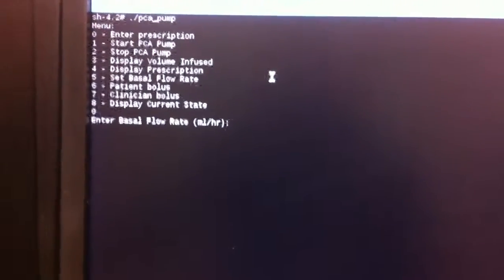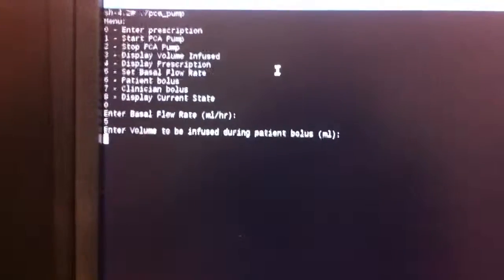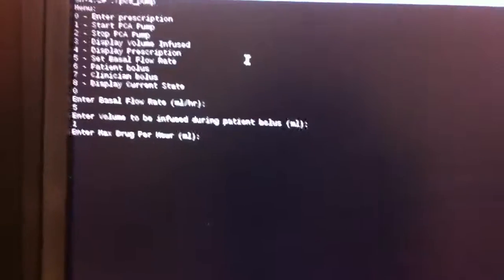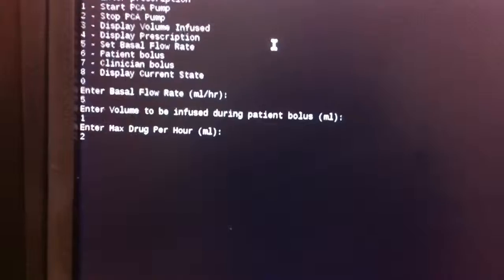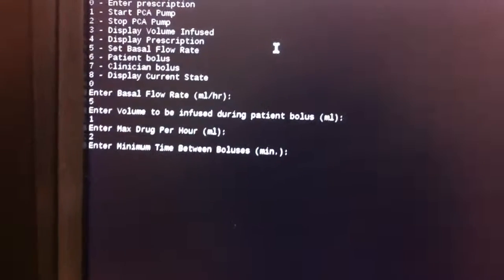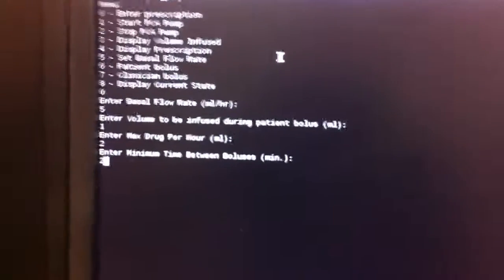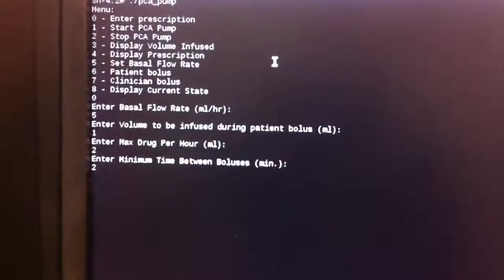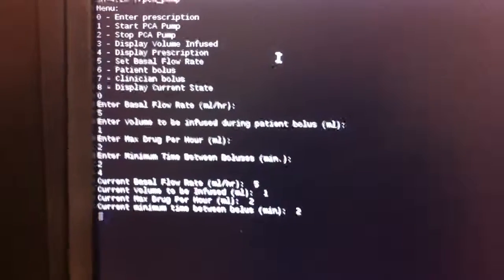infusion. So let's say I put 5 milliliters per hour for the basal flow rate, and then for each patient request I put 1 milliliter, and for demonstration purposes I will put a 2 milliliter limit, and I will allow the patient to issue a new request every 2 minutes. So here, to confirm, I can display the prescription, everything is fine.